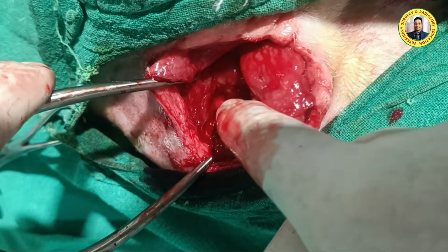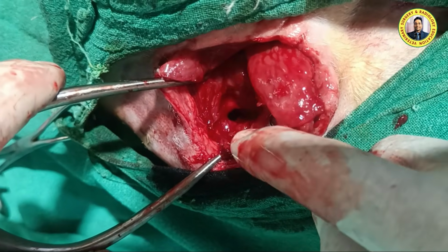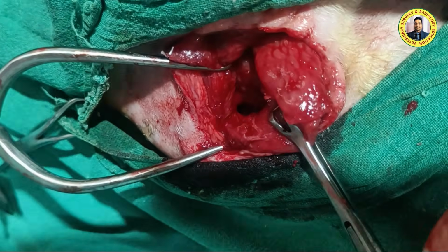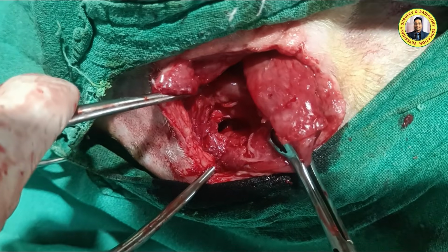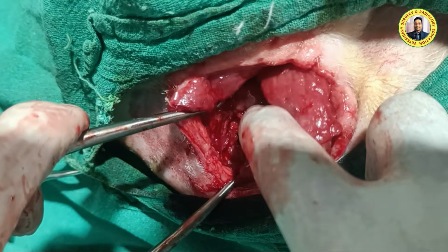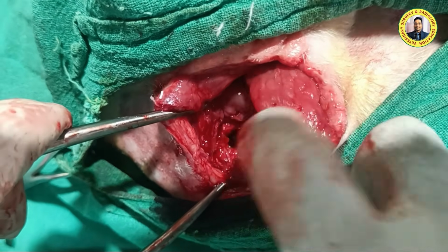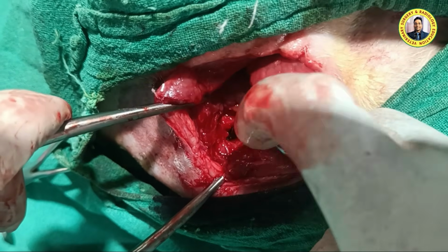We first pre-place the thread and then we pull, and at the time of pulling we ask the assistant to inflate the lungs completely so that we can create negative pressure inside the thoracic cavity. It is very difficult to show all this uninterrupted, so here I am taking a pause, and after repair I will come back.